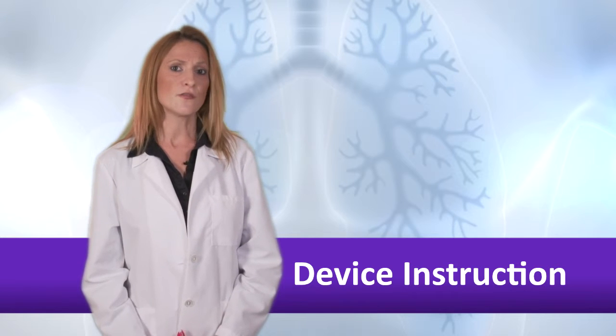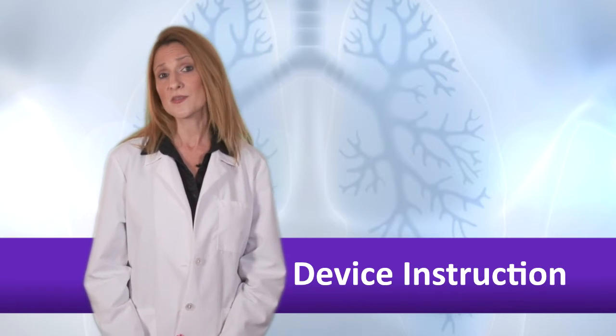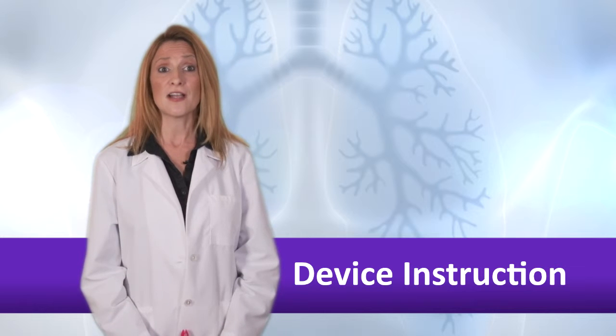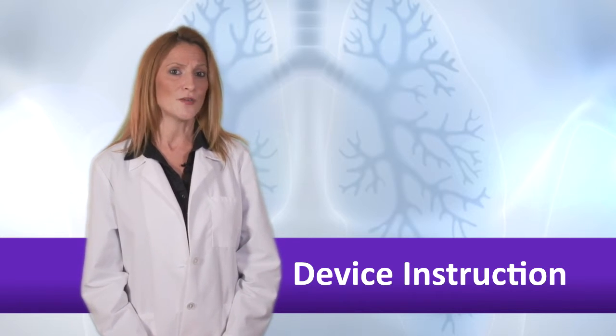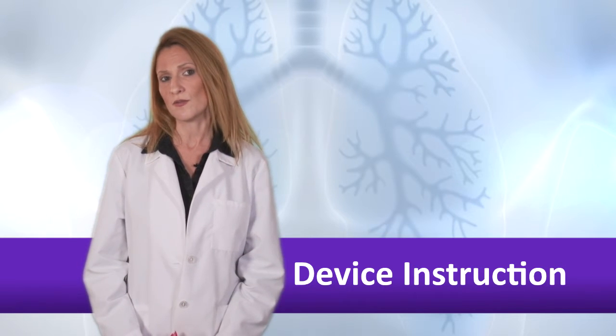The ideal frequency for reassessment is not known. The asthma guidelines have suggested checking device technique at each visit. However, checking this often may not be practical in every practice and for every patient encounter.